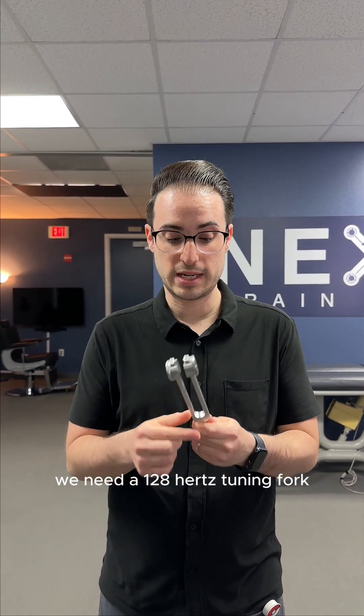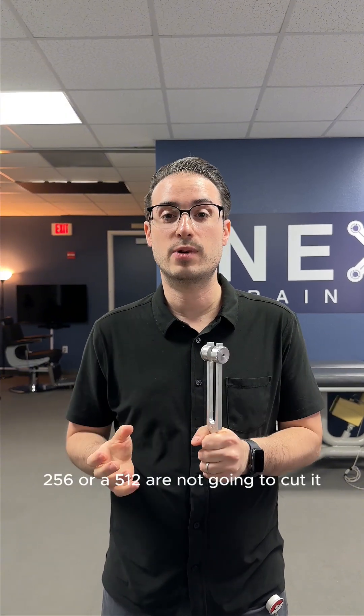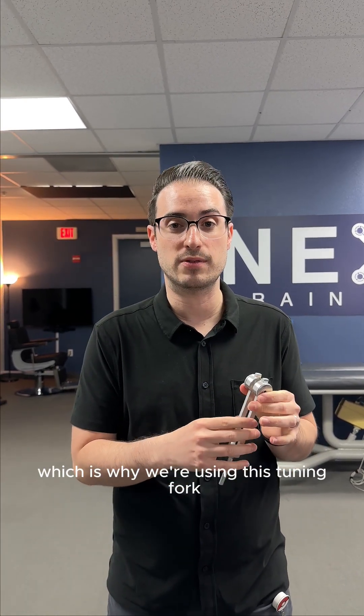First, you need the right type of tuning fork. We need a 128 hertz tuning fork. A 256 or a 512 are not going to cut it — those are used for hearing tests, not for vibration tests, which is why we're using this tuning fork.